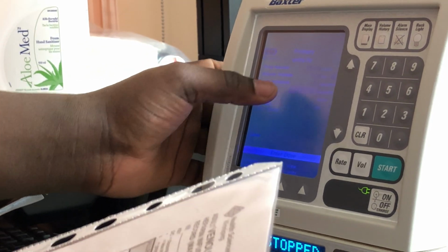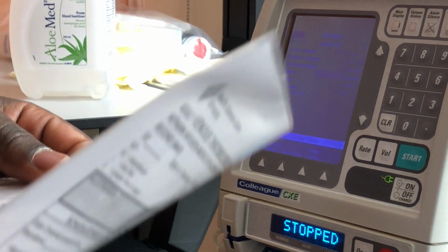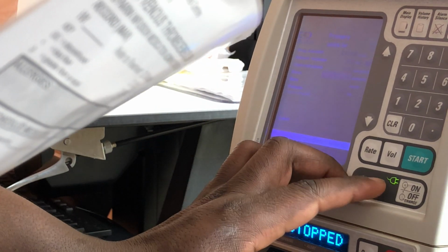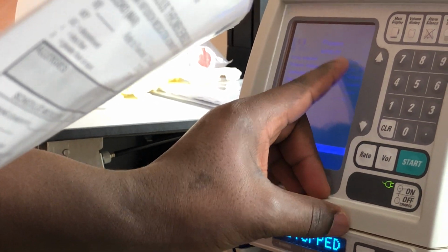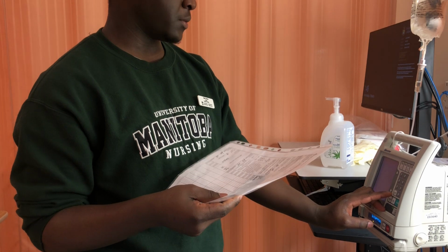Concentration is 100 units per ml, and then the dose. I've already created a label. So the dose will be 1,350 units per hour. That's the rate at which the patient will be running the infusion.